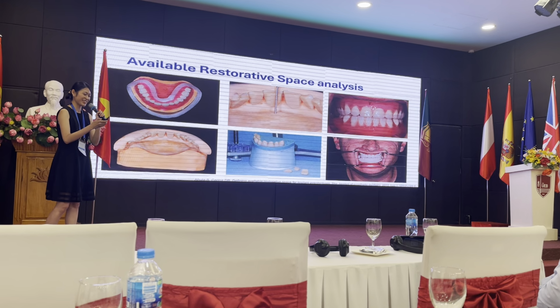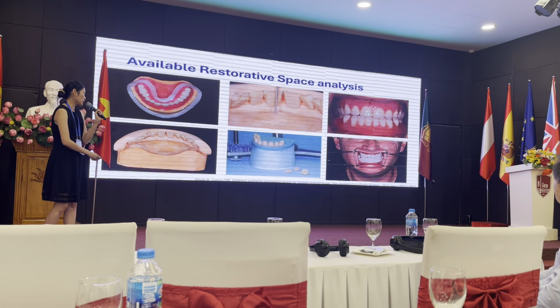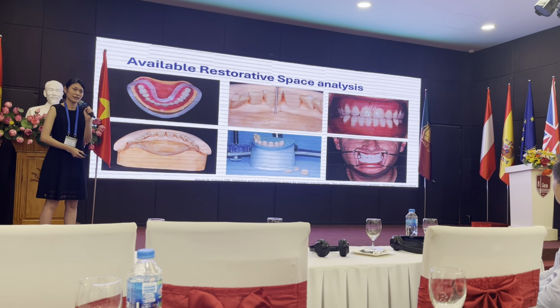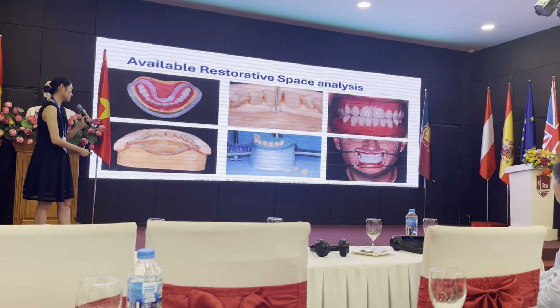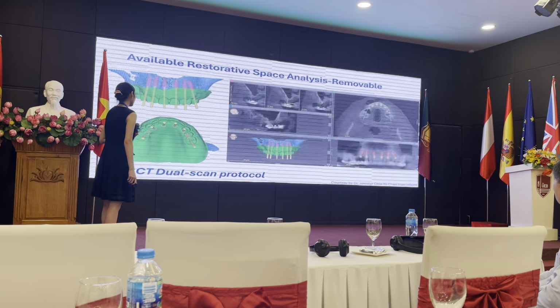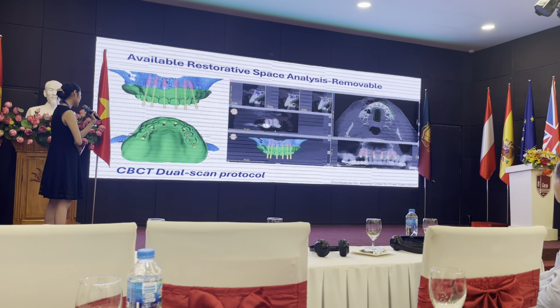And there's another way to do this. You can also deliver your denture first, and you can duplicate your denture or 3D print a denture and put a visual marker on the top of it and merge with your CBCT. Then put it in the software to see how much restorative space that you have. Và kết hợp với cả phim CBCT thì chúng ta có thể quan sát được cái khoảng phục hình mà chúng ta có.